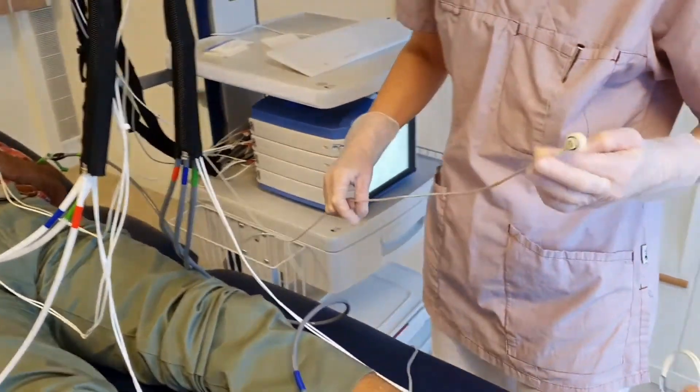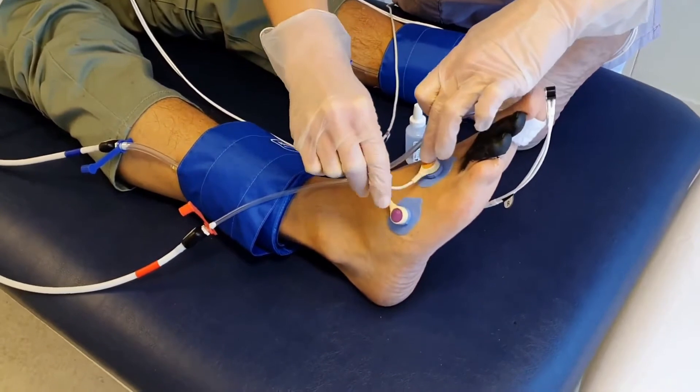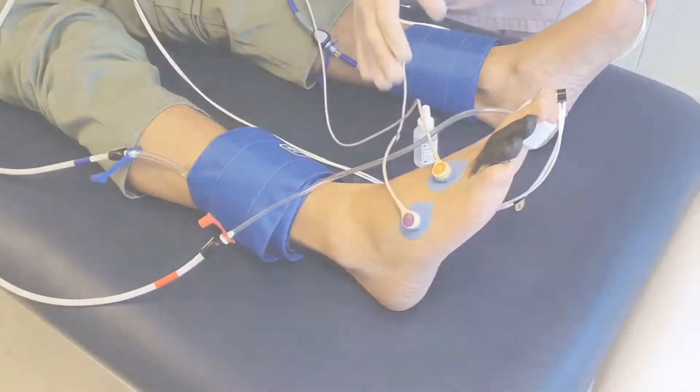amputation level determination, and evaluation for hyperbaric oxygen treatment. To save time, TcpO2 measurements are performed simultaneously with the pressure measurements.